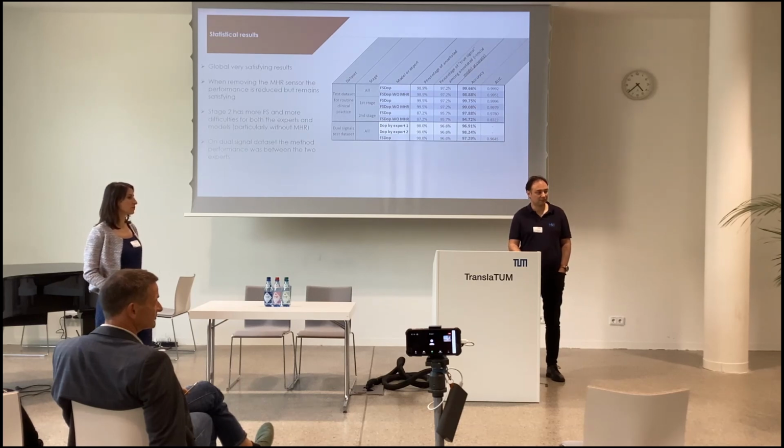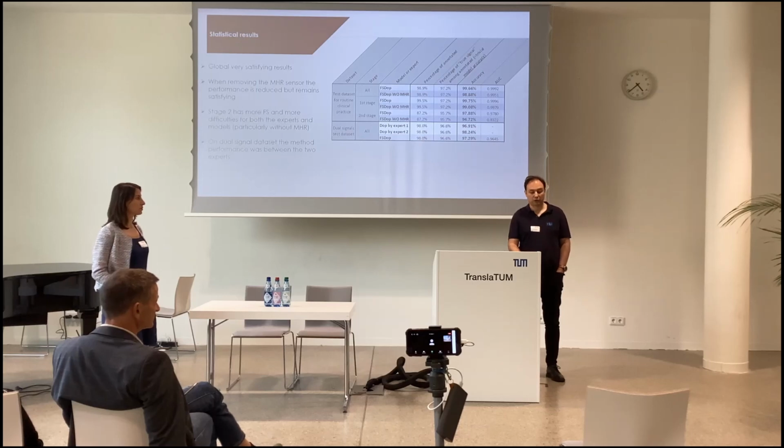is this meant to be real-time detection or retrospective batch detection? For now, it's only retrospective. The computation time is very low. It's 1 second for 1 hour recordings, even without a GPU, on a CPU processing only 1 recording at a time.